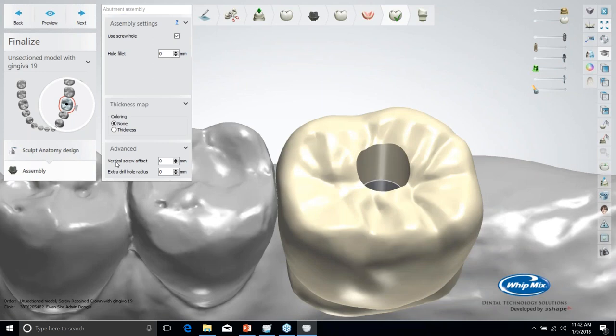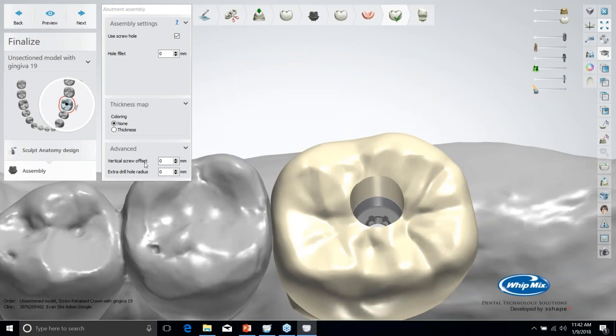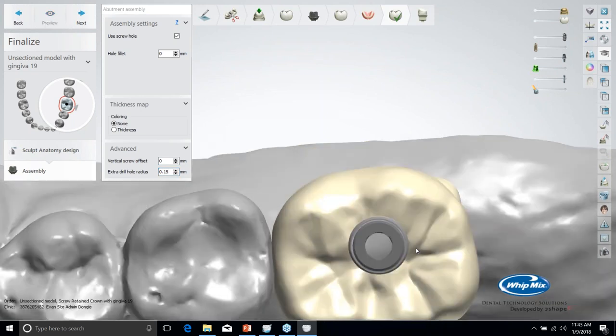Vertical screw offset has no effect on tie bases, but what it does is if you were doing like a full contour, or solid titanium custom abutment, whatever value you put in here will vertically offset the engagement lip for the screw. Extra drill hole radius, that's just going to increase the diameter of that screw hole. So you can see that gave me a little extra room there.